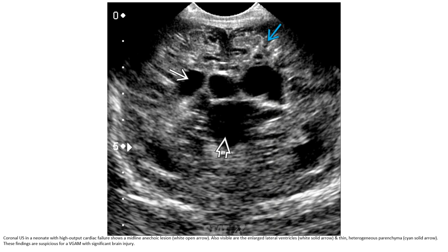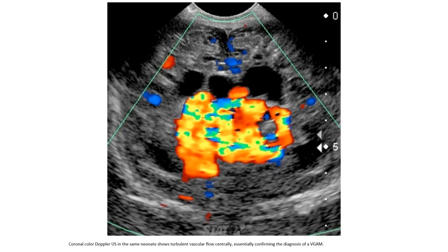Again, this is an ultrasound in a neonate with high output cardiac failure, showing a midline anechoic region, also visible as the enlarged lateral ventricles and thin heterogeneous parenchyma. This finding is suspicious for vein of Galen aneurysmal malformation with significant brain injury. The same patient on Doppler ultrasound shows turbulent vascular flow centrally, essentially confirming the diagnosis of vein of Galen aneurysmal malformation.